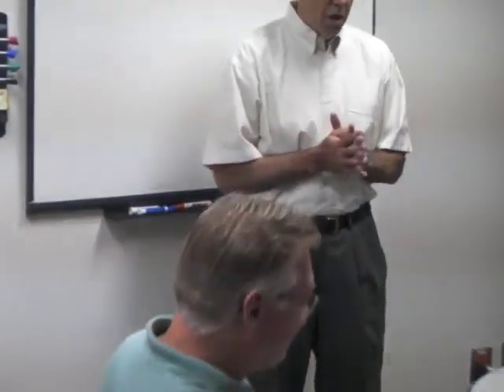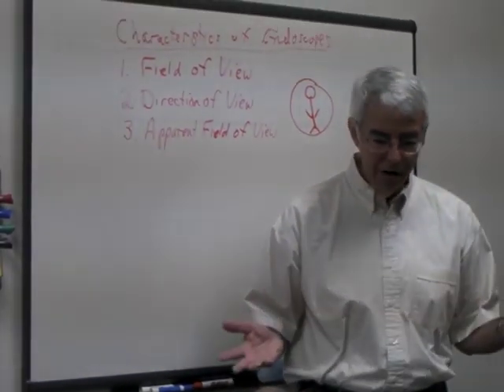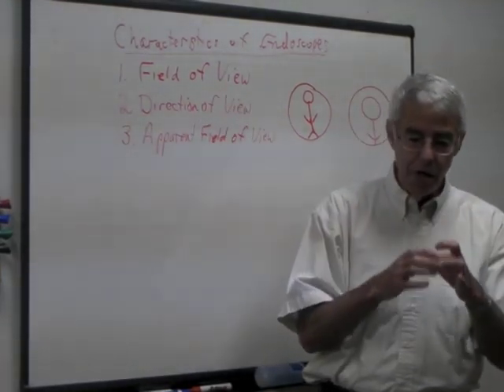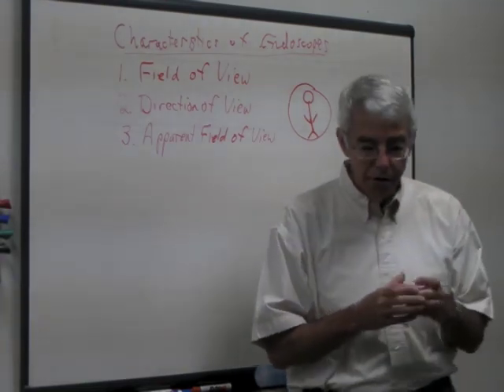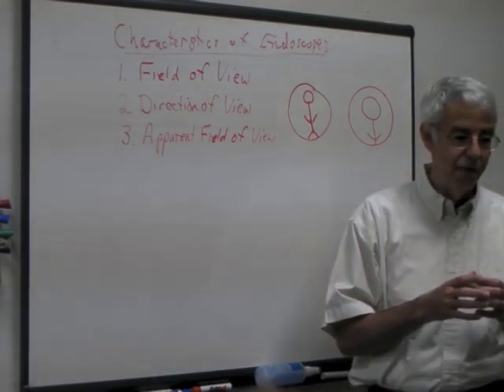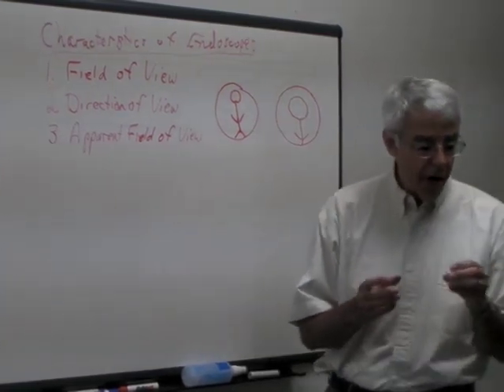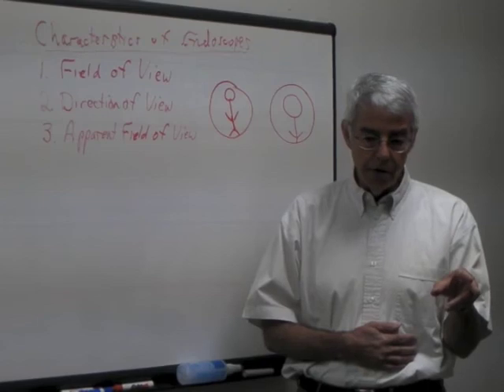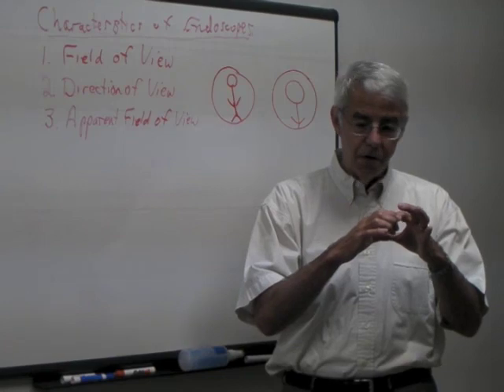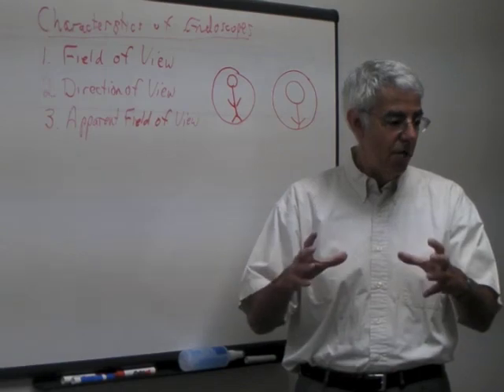So we're looking through the scope. You have no idea what the field of view is because you've covered it, but you're seeing a bigger circle. The size of that circle is proportional to the apparent field of view. Okay, so who cares? The reason we care is that when you connect up these endoscopes to a camera system, the size of that circle translates to the size of the image circle on the monitor.